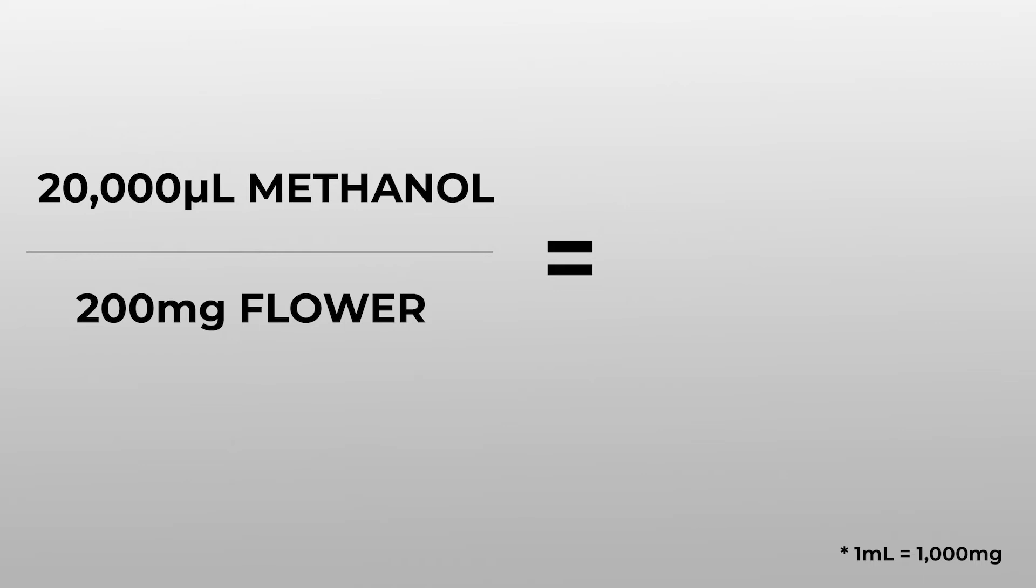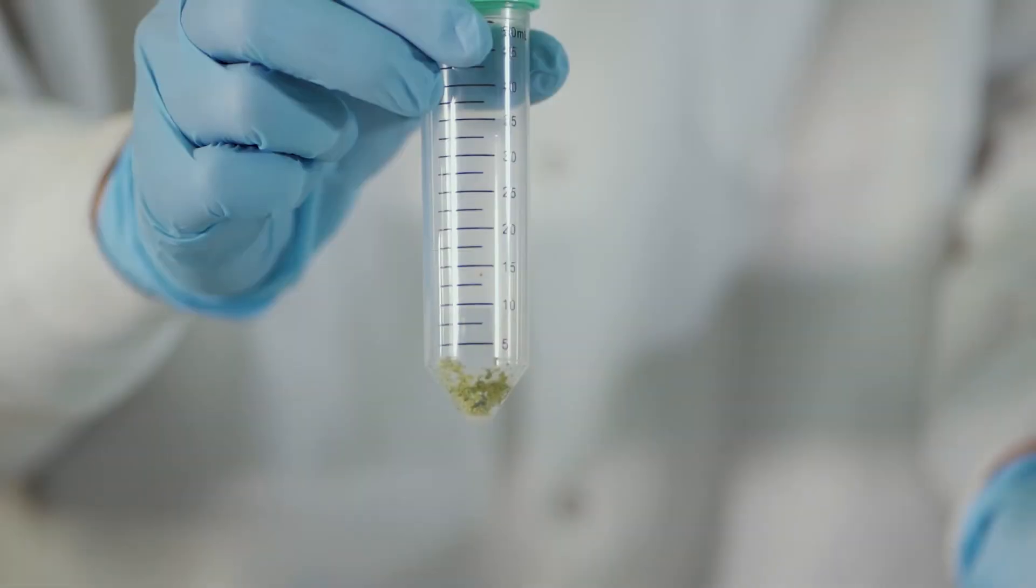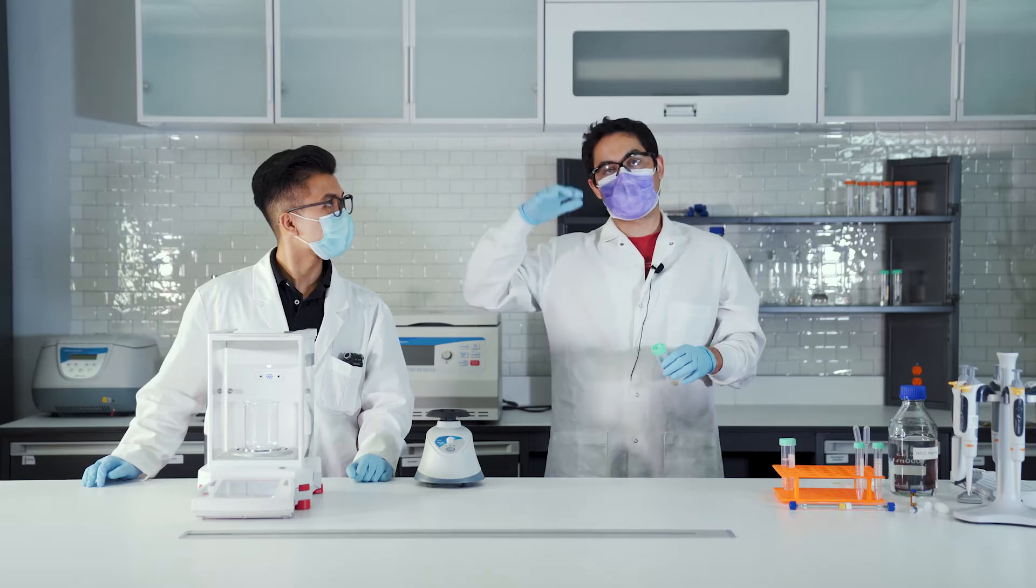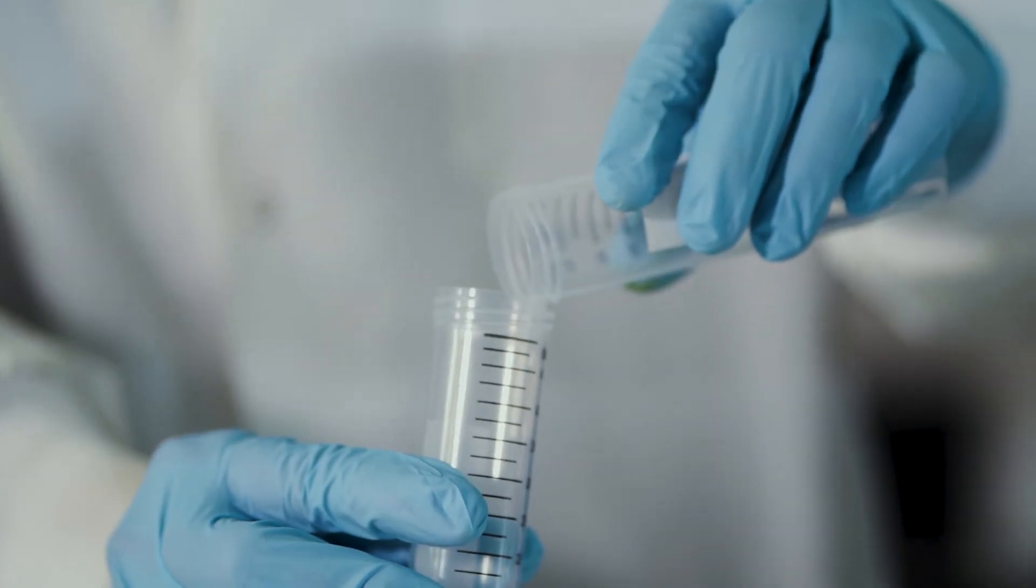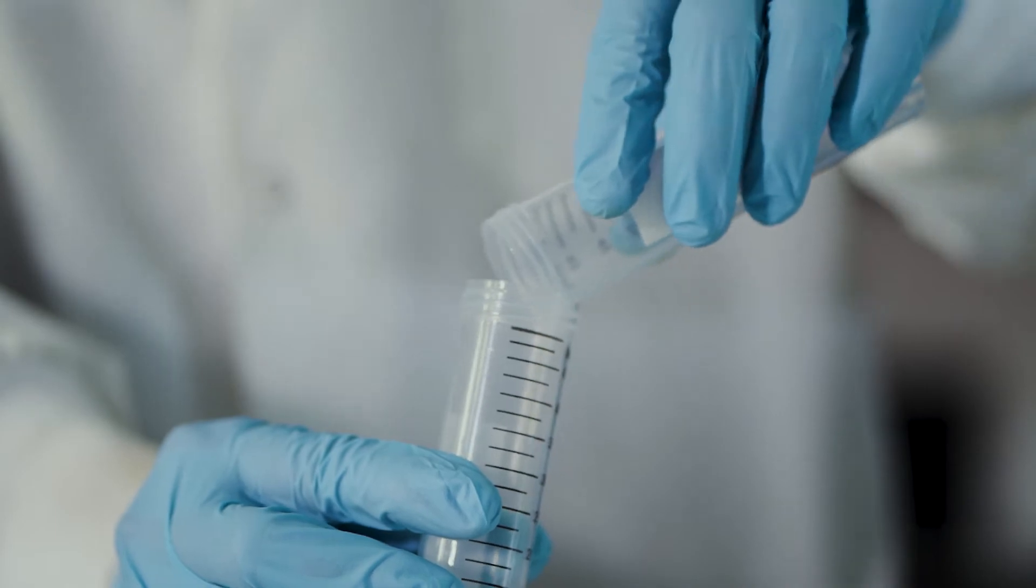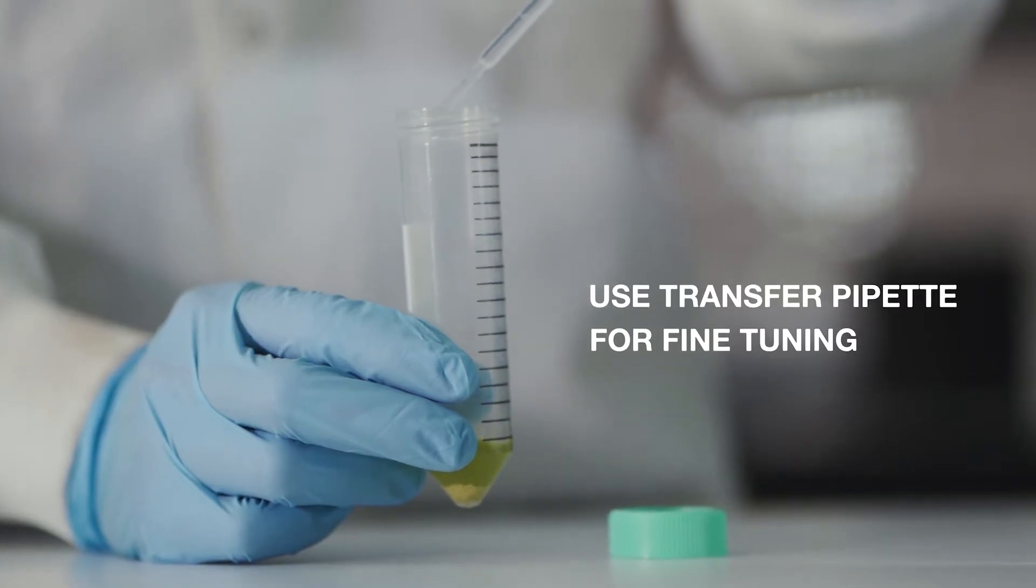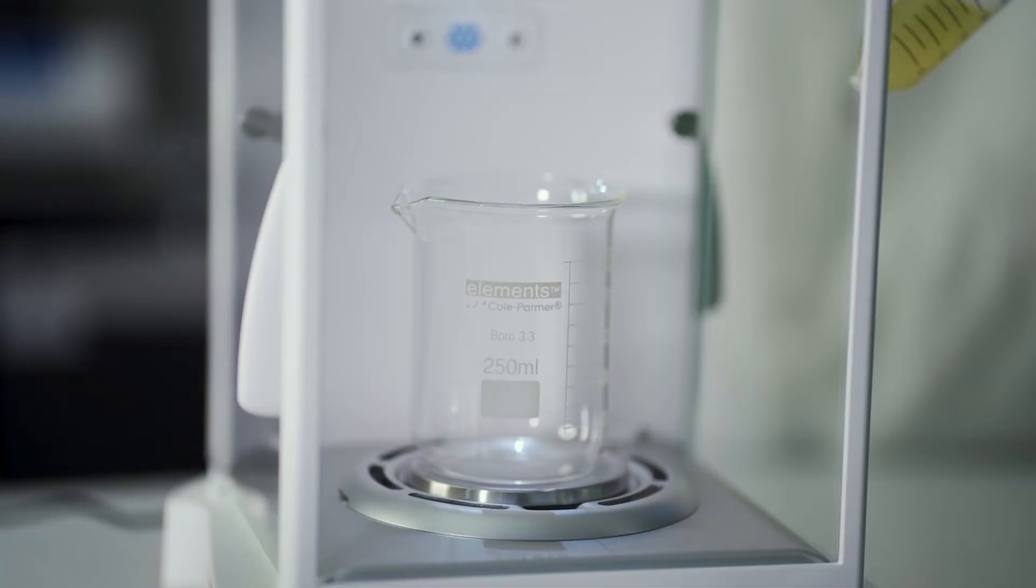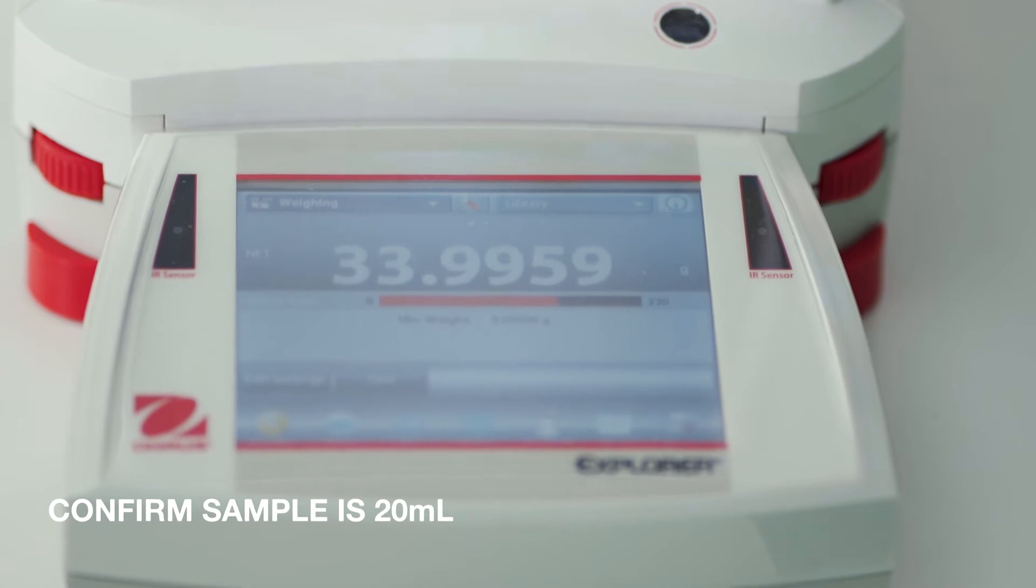Now that we have our sample in the centrifuge tube, we want to dilute it up to 20 mils. We're gonna go ahead and dilute up to the mark. When I'm getting pretty close, what I like to do is I like to use a transfer pipette for fine-tuning. Then just to be certain, we can go ahead and weigh it and record the weight.